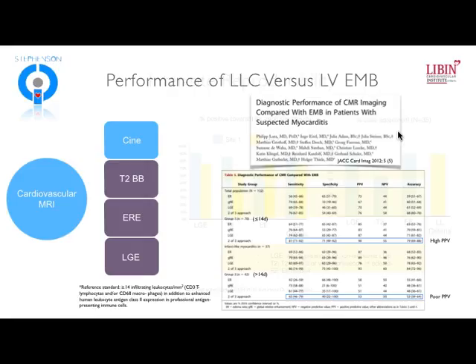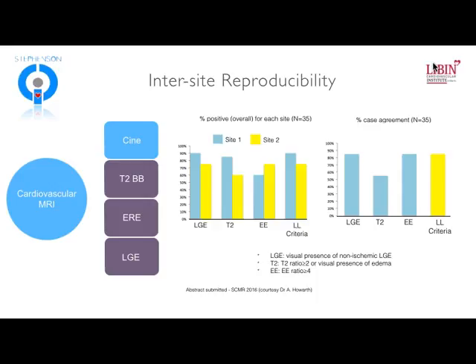In patients, however, that were more than 14 days beyond their symptoms, you actually see the positive predictive value drop substantially, down to about 50%. So while endomyocardial biopsy continued to show evidence of myocarditis, the imaging findings associated with that started to fall off in being able to identify these patients.